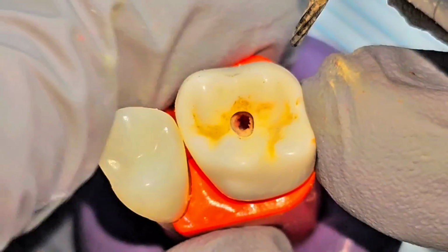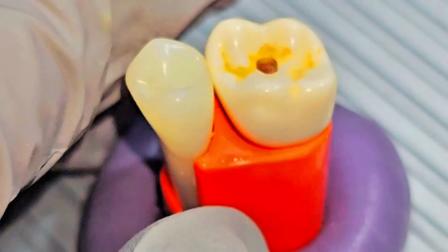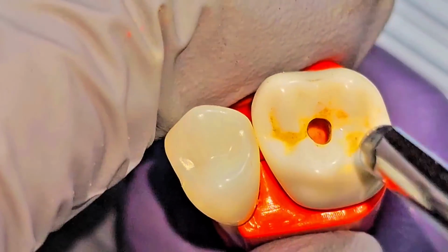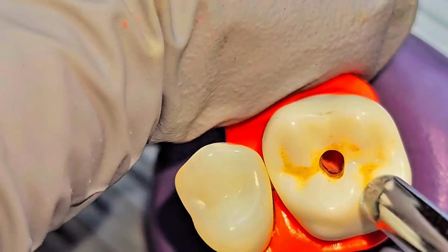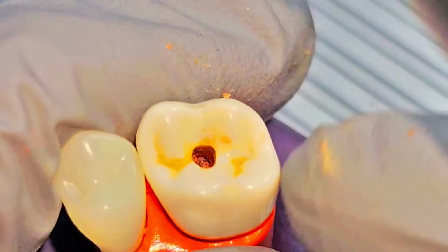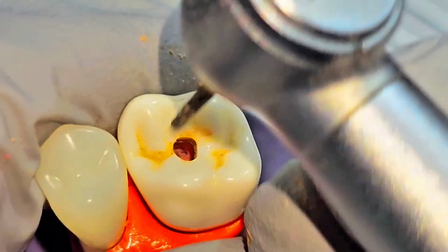Now we are getting closer to the shape. Still we are within the boundary.